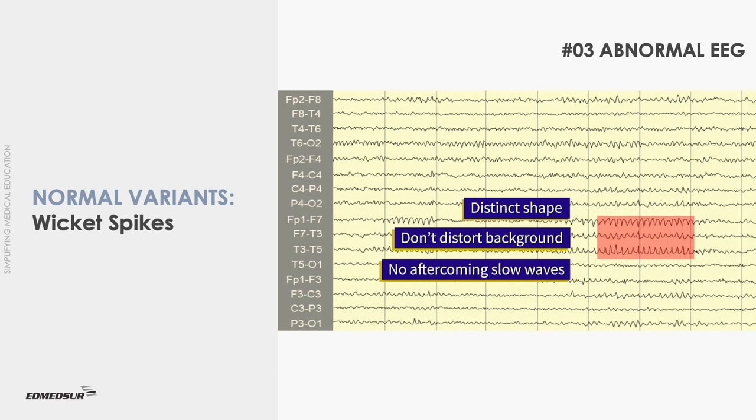In distinction to epileptiform discharges, wicket spikes have a distinct shape, they do not distort the background, and do not have an after-coming slow wave.